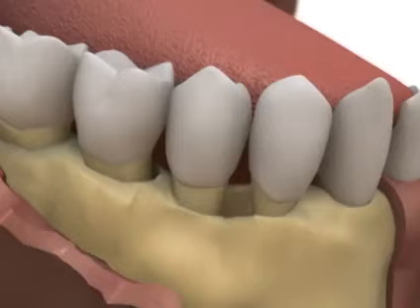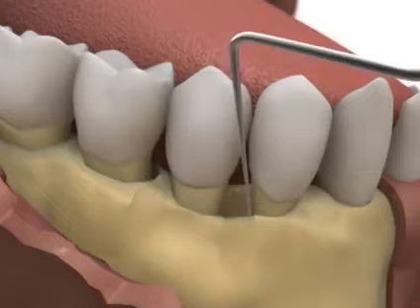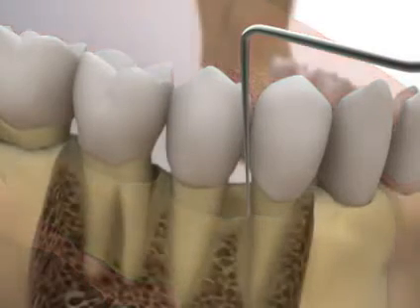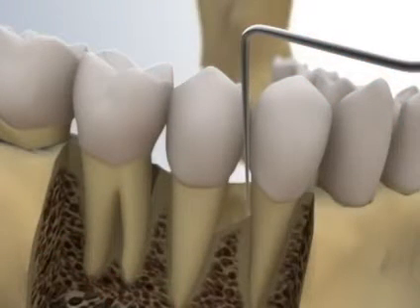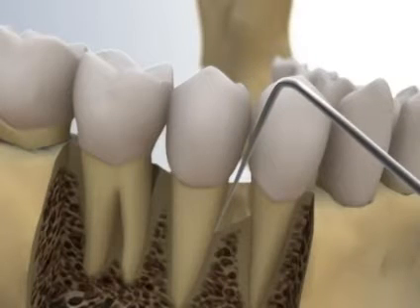In this particular case, the osseous defect between teeth 4-4 and 4-5 is a shallow 2-wall defect. The buccal and lingual walls are present, but there has been interproximal bone loss. There is more significant bone loss on tooth 4-5 mesial. As a result, the crater slopes apically from tooth 4-4 to 4-5.